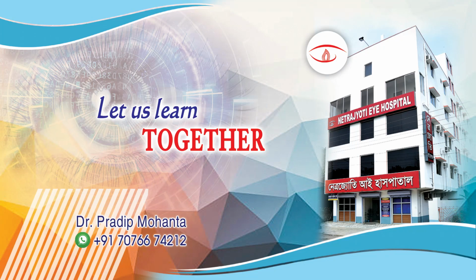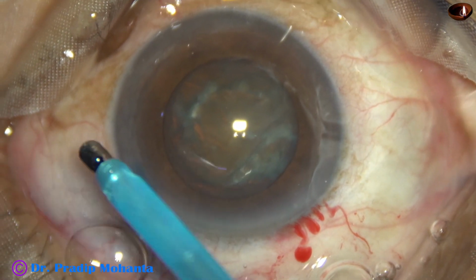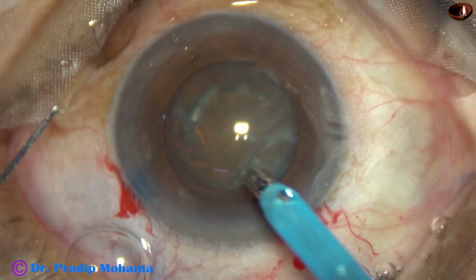Friends, welcome to my workplace at Ranaghat, West Bengal, India. In this video, we are going to see management of a posterior capsular rent.